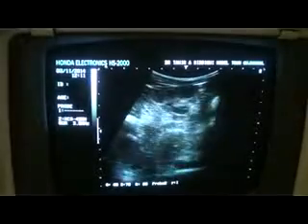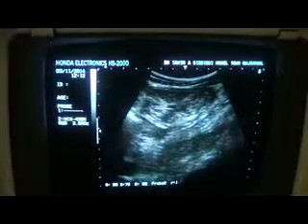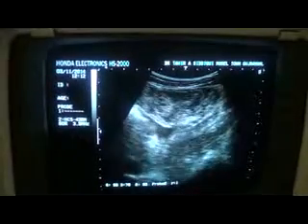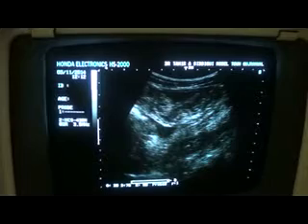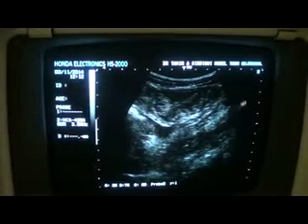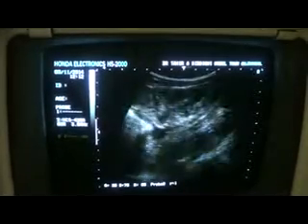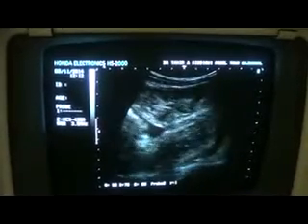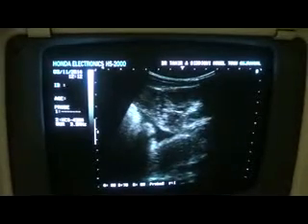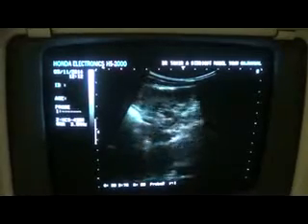This is the right lower abdominal quadrant, and this is the bowel segment, and this is the iliopsoas muscle. There is fluid in it, and you will see that the bowels show meager, very slow peristaltic movements.